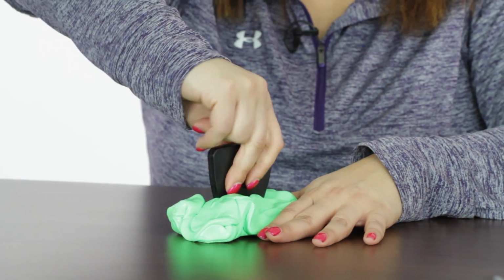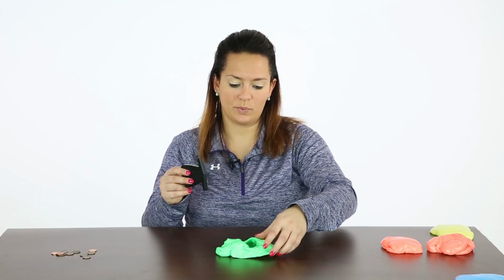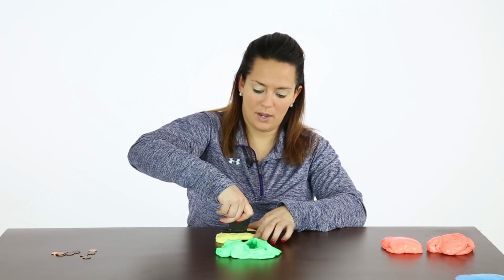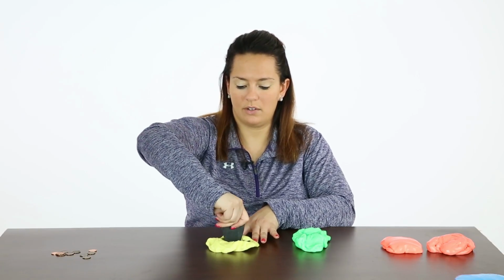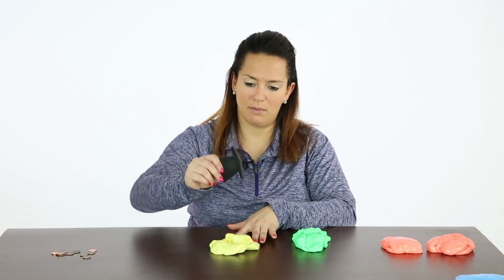And if this resistance is too difficult, all these tools work with the various resistances too. So soft would be the same way. Pushing in and hiding and turning. You can see that's a little easier than the medium. Still simulating the same key turn.